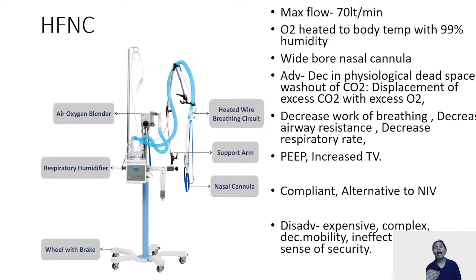Coming over to the high flow nasal cannulas, which became very famous during the COVID times. Again, these cannulas are less cumbersome than your face mask, because in those face masks, the patient can feel claustrophobic. The patient won't be able to eat or talk. So it becomes highly cumbersome for the patient to have that very hard, huge mask over the face. Then came the high flow nasal cannulas. These are nasal cannulas which are inserted into the anterior nares. This is the nasal cannula.